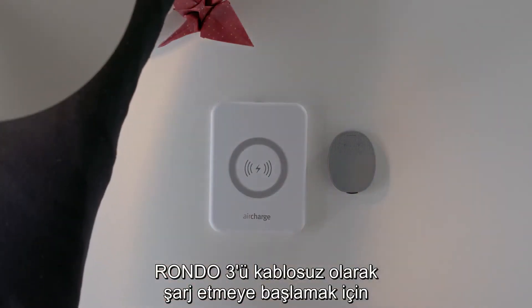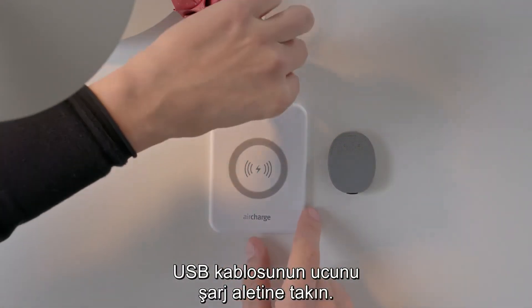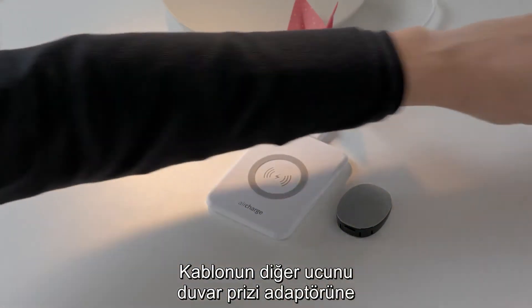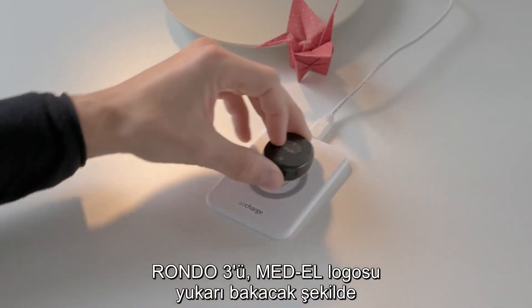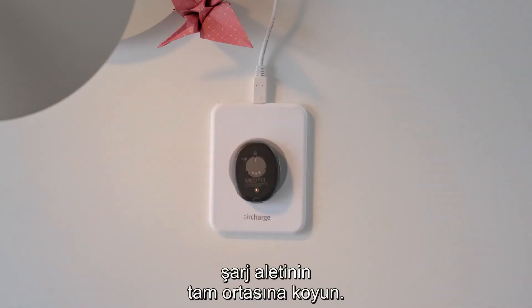To start charging RONDO3 wirelessly, plug the USB cable into the charging pad. Plug the other end into the wall plug adapter or into a USB port. Place the RONDO3 in the exact center of the wireless charging pad, with the MED-EL logo facing upwards.